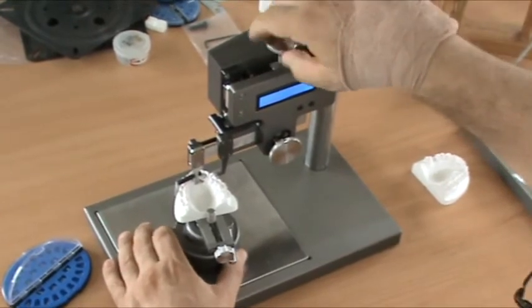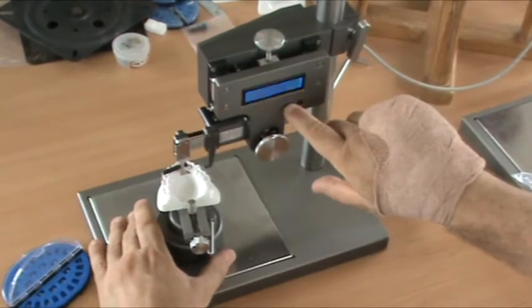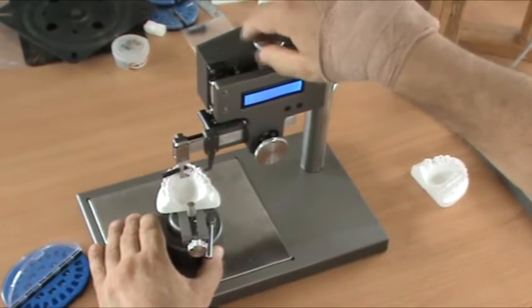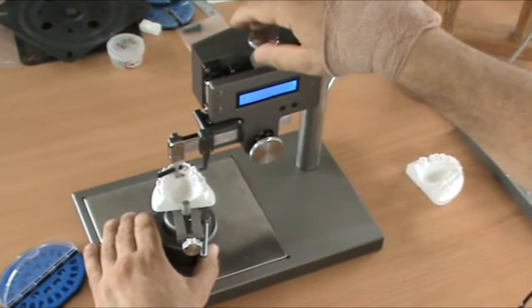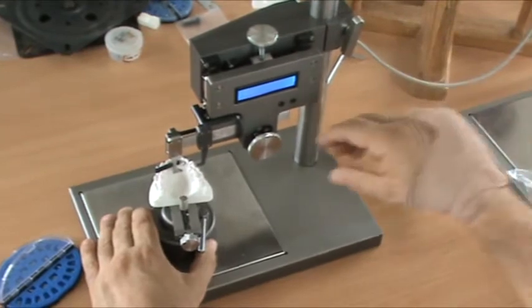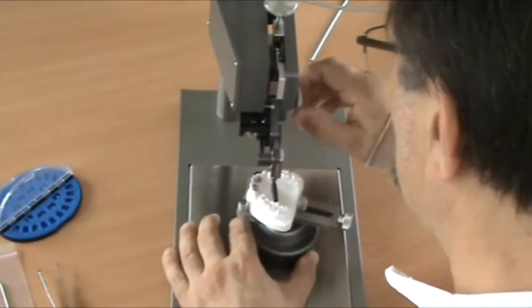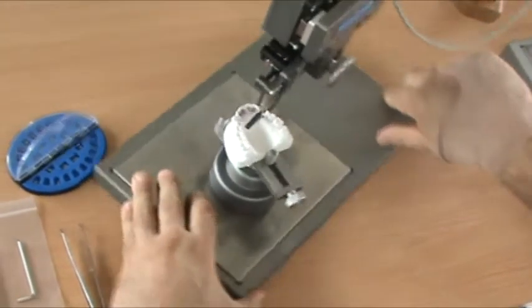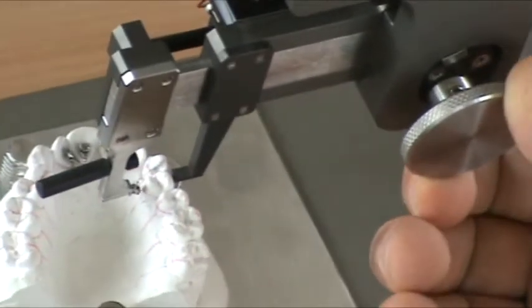This is just showing you how the instrument works. So we get a light contact here and then you can zero. And then we can measure height. So for instance, if I wanted to place this bracket at 3.5 millimeters, I would stop at 3.5. And then I can use the instrument to bring the bracket to the tooth.